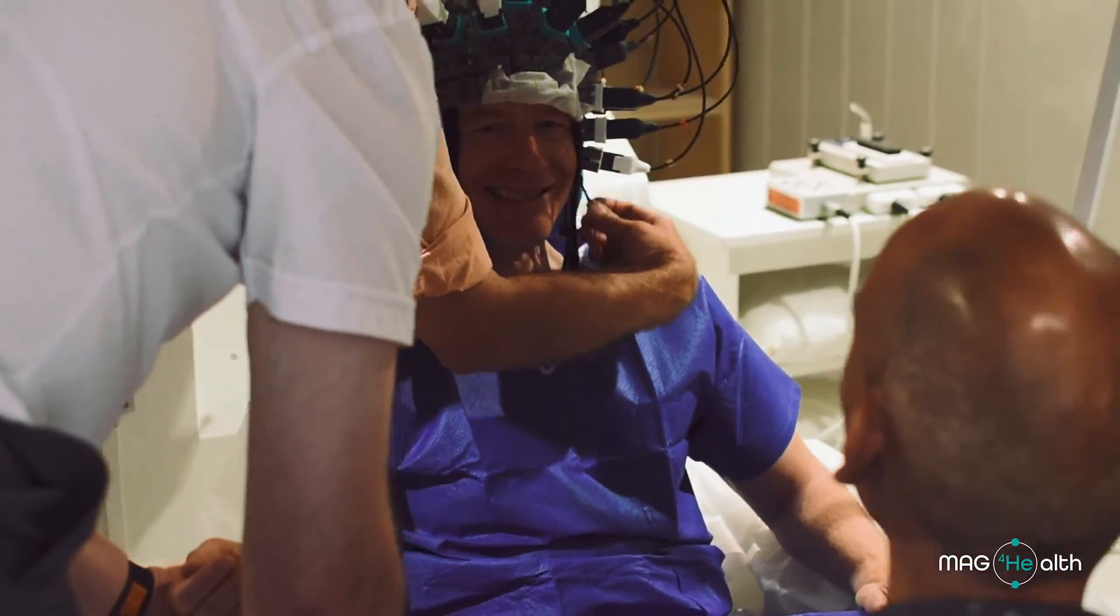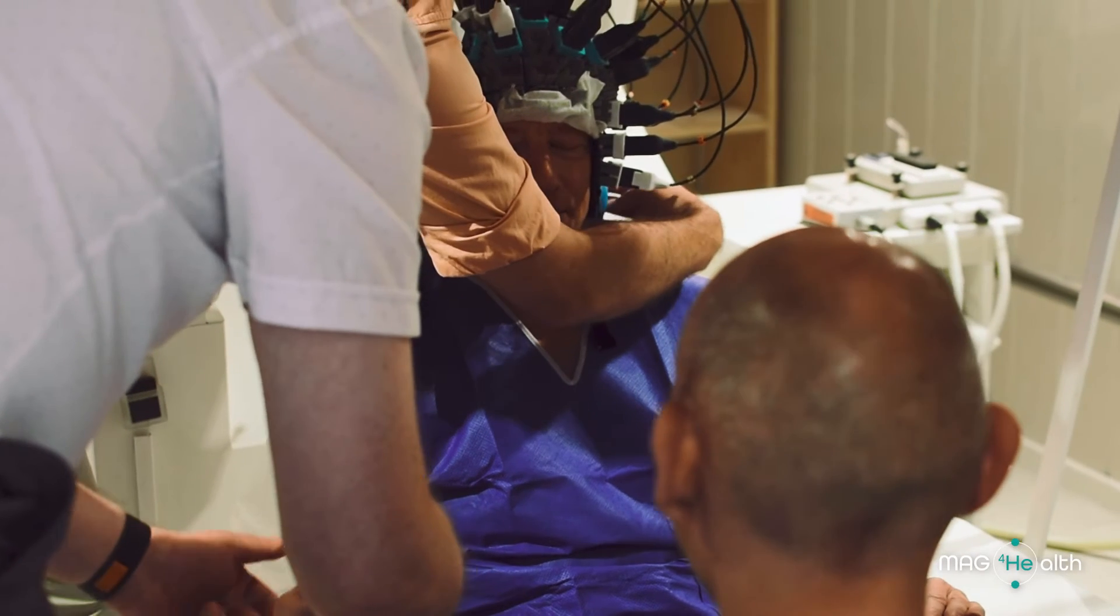It's completely amazing because we can follow in real time what is happening in the brain.